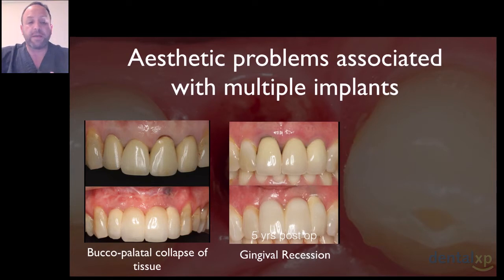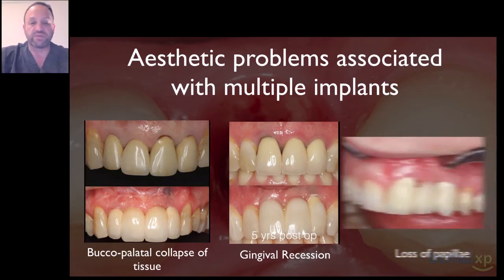And with these types of techniques, in this type of situation, we are lucky in that we now have the techniques pointed out by Garber and Salama and by Coachman, where we can use wonderful pink composites to start to work these things. But what we're really looking for is something that prevents this kind of thing from happening, and that's what we're going to talk about today.